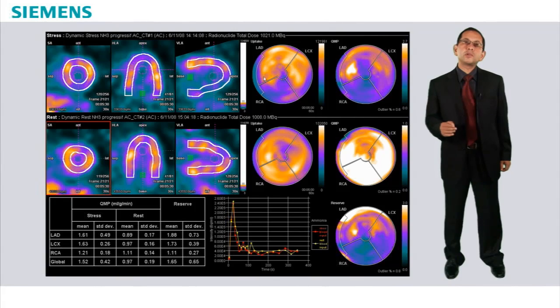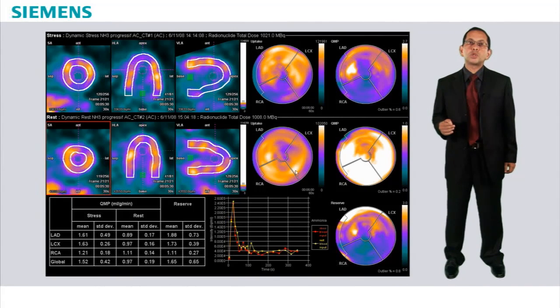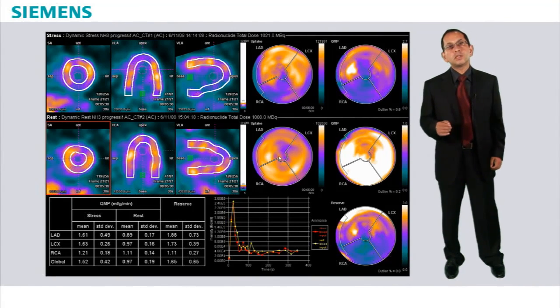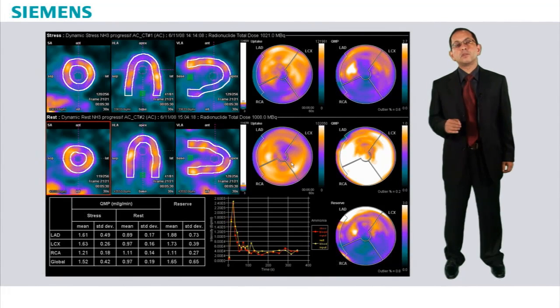Now we can look at the stress and rest uptake polar plots which show a very large inferior wall defect with significant improvement of uptake in the resting study, suggesting reversible ischemia in the right coronary artery territory.